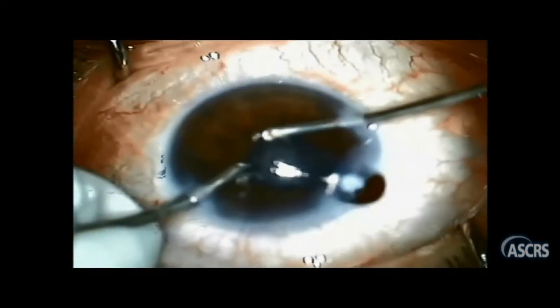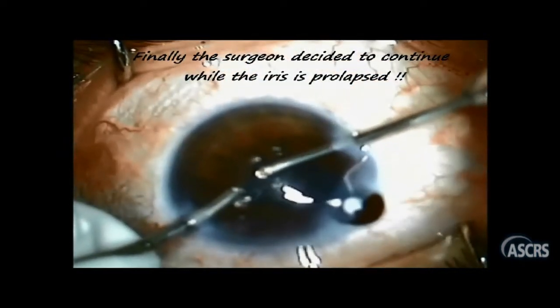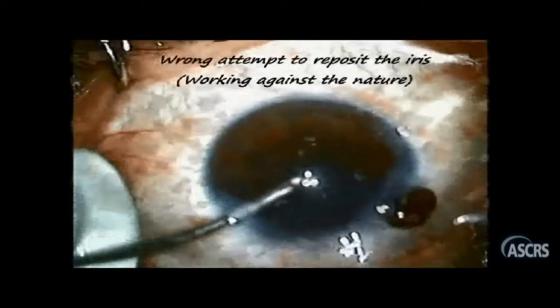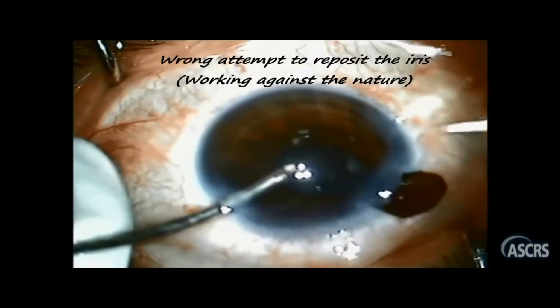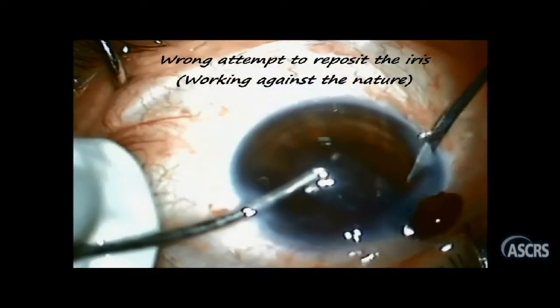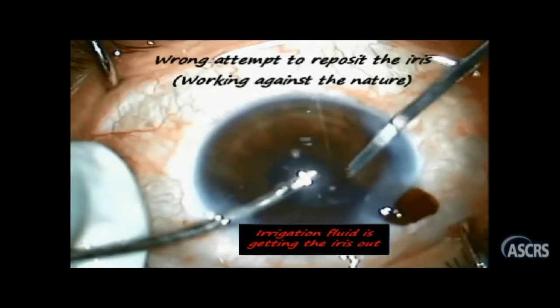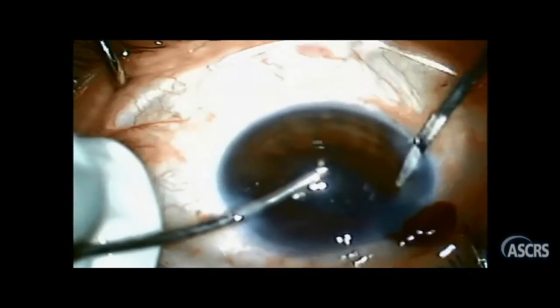To my greatest amazement while watching this video, she decided to go on with irrigation aspiration trying to remove epinucleus and cortical matter, paying no attention to the prolapsed iris tissue. Finally, the surgeon started to think about the iris. With a very aggressive unskilled move she tried to reposition the iris using a spatula, but with the irrigation probe still inside the eye pushing the iris out — acting against all the laws of physics, acting against nature. And that's most probably the cause why all her previous maneuvers for iris repositioning failed.